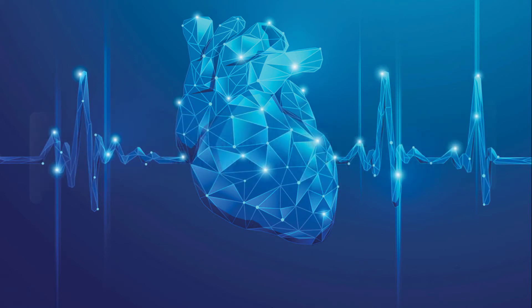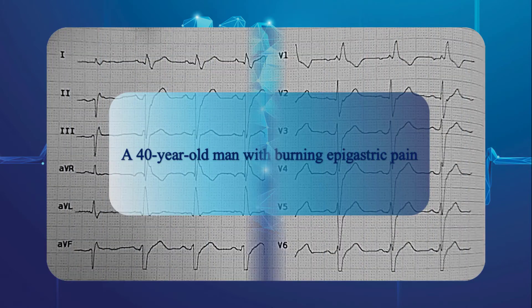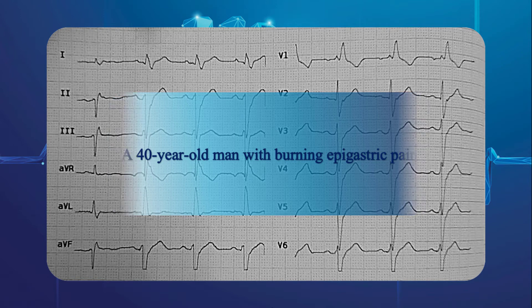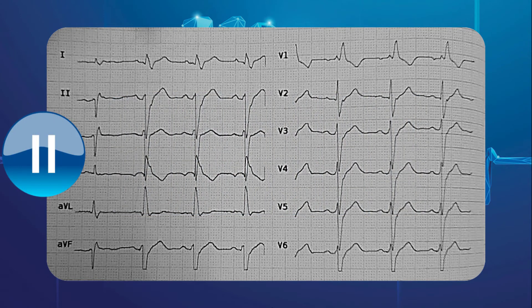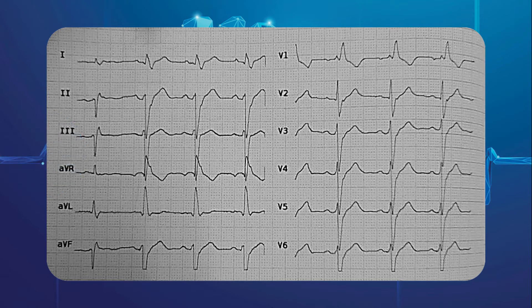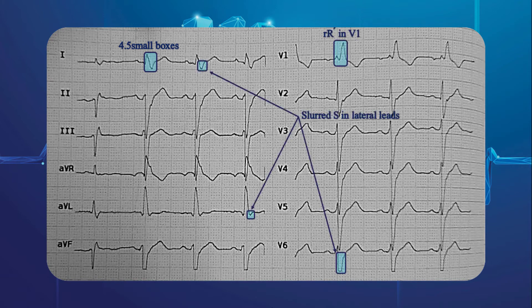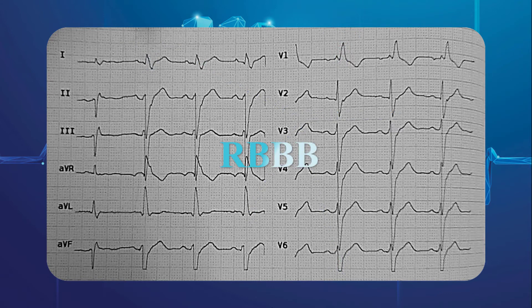Our second strip is taken from a 40-year-old man with burning epigastric pain. Again, pause the video and do it yourself, then we go through it together. QRS complexes are obviously broad. Other associated findings are RR prime pattern in V1 and slurred S wave in lateral leads. So the QRS complex changes are owing to RBBB.